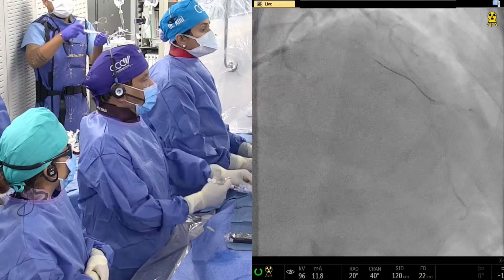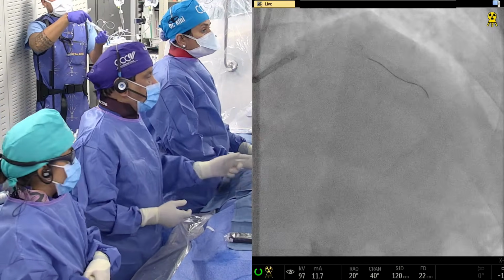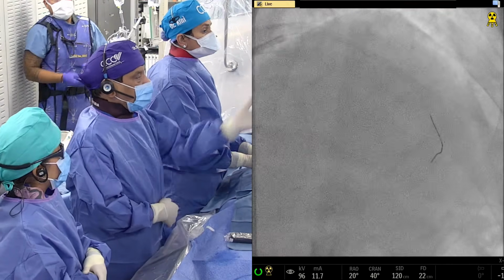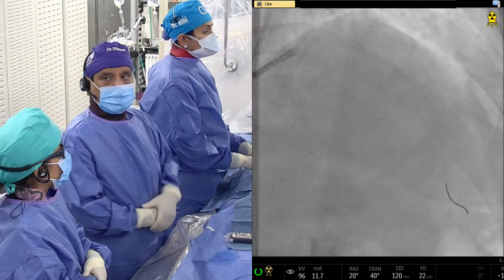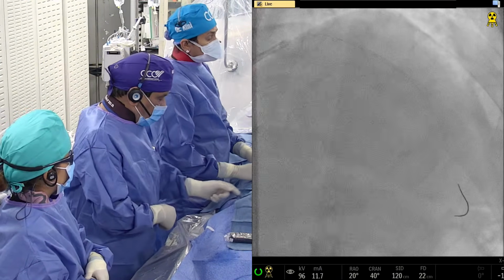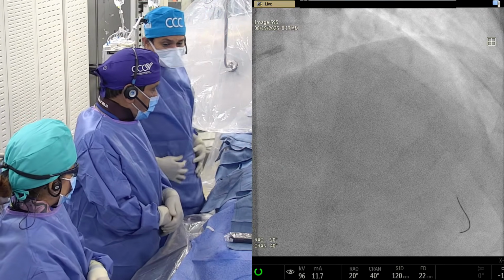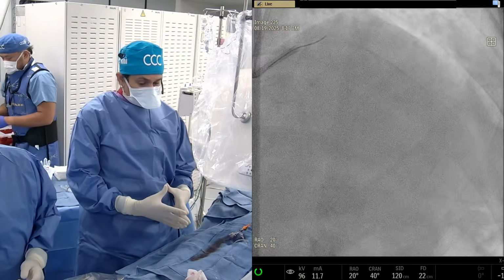As far as the need for FFR or iFR at the baseline, I would say it is not there. The patient has a significant ischemia. We know that with this lesion, even if you don't have a stress test, FFR will be positive. So tell us what is your plan. Now you have wired it with the run-through wire. Yeah. Wiring, balloon and stent. Torque-free approach. Okay. All right.